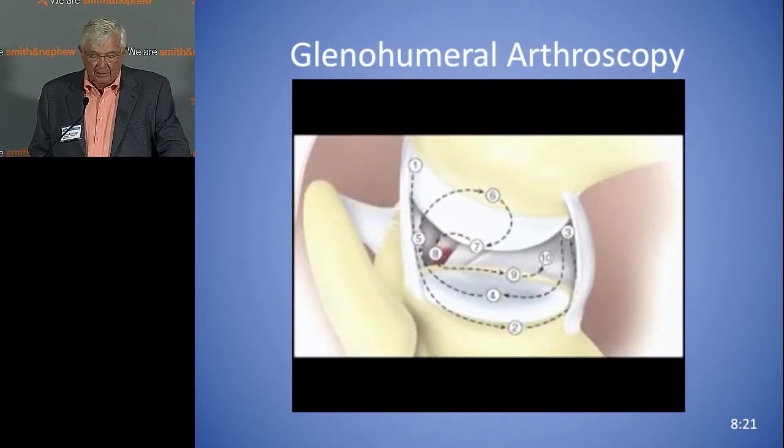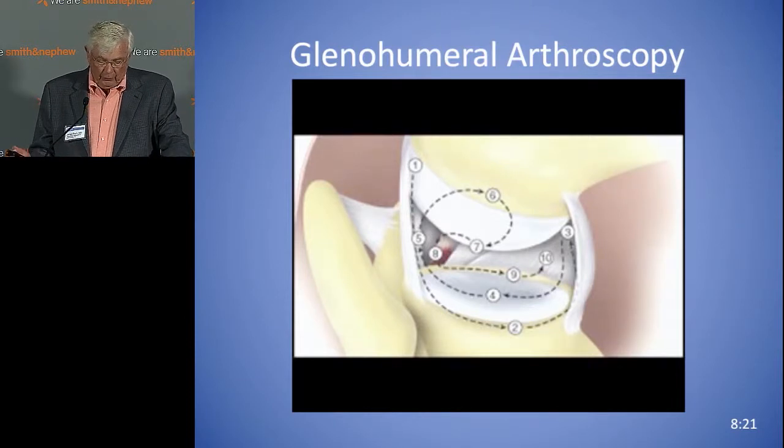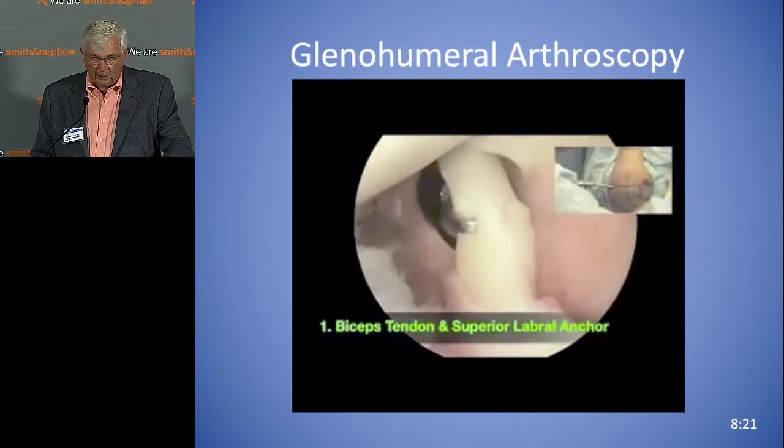Now you can see one, two — across the bottom. Then you go into the axillary pouch and come off the glenoid.